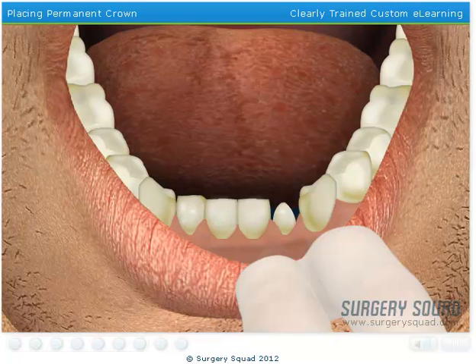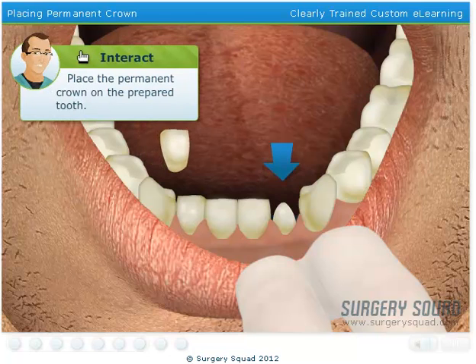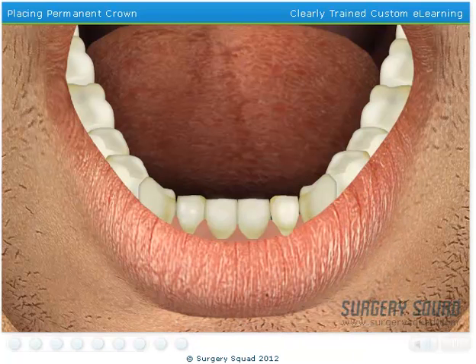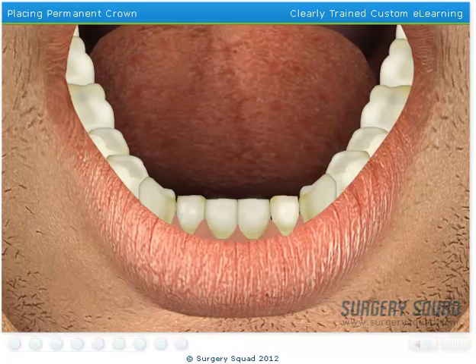I've already checked the fit and color of the permanent crown and everything seems great. I've applied cement on the inside of the crown, so it's ready for you to place. Perfect! After the cement has hardened, the dentist would check the fit of the crown again and the patient's bite to ensure that there are no issues. Luckily for our patient, you did a marvelous job!